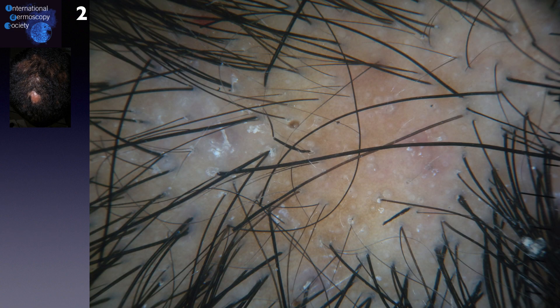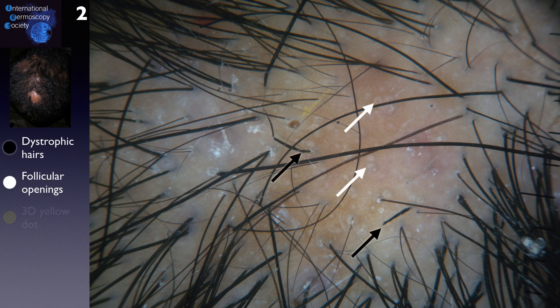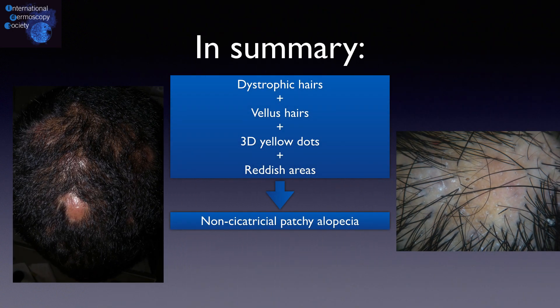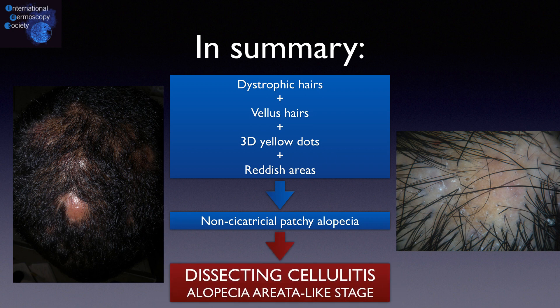Another plaque shows more dystrophic hairs, follicular openings, and a large 3D yellow dot. In summary, the findings of alopecia areata such as dystrophic and vellous hairs, with the presence of 3D yellow dots and reddish areas, could represent dissecting cellulitis in a very early and non-cicatricial stage of the disease.